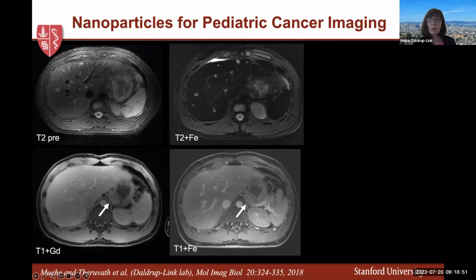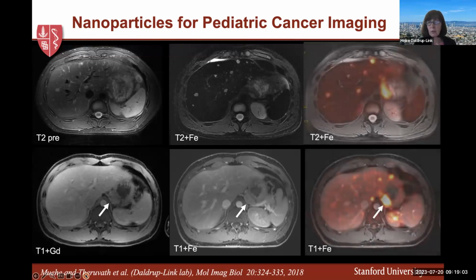And then on the T2 weighted scan, you can see metastases much better than on the unenhanced scan. So they're much better delineated. And again, here you see the PET information. And even for these small metastases, we get a perfect co-localization of the PET signal with the MRI.